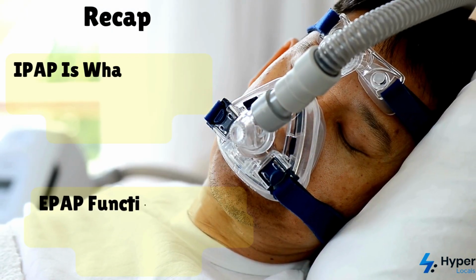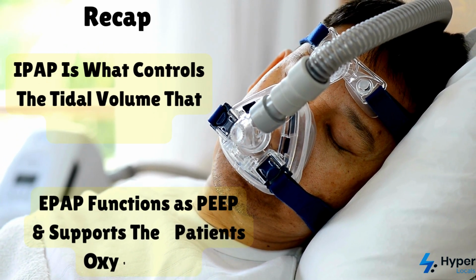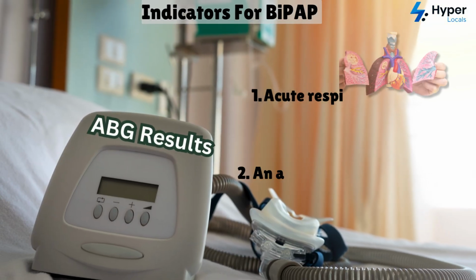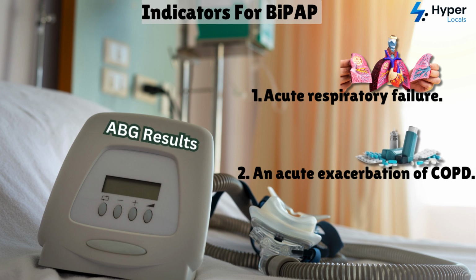So just to recap, IPAP is what controls the tidal volume that is delivered. EPAP functions as PEEP and supports the patient's oxygenation. There are two primary indications for BiPAP. 1. Acute respiratory failure. 2. An acute exacerbation of COPD.